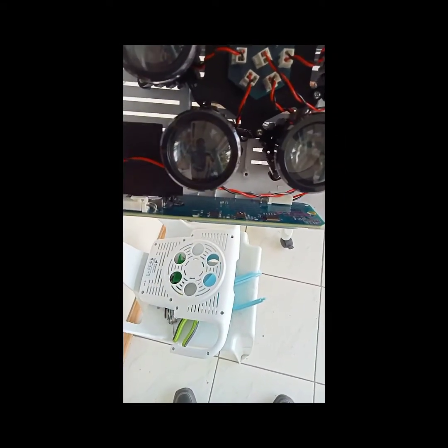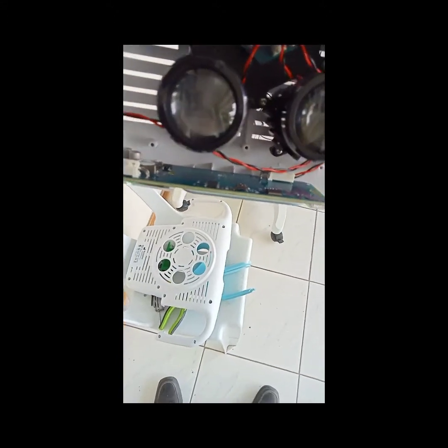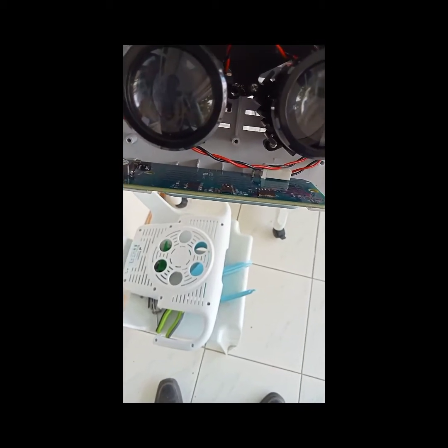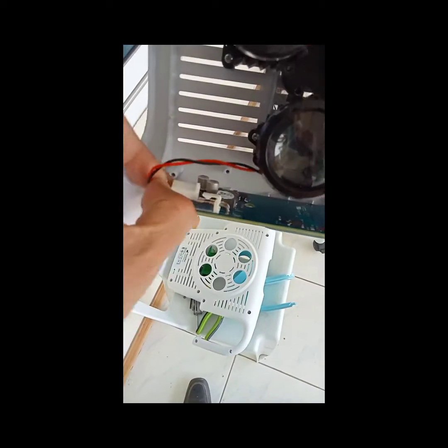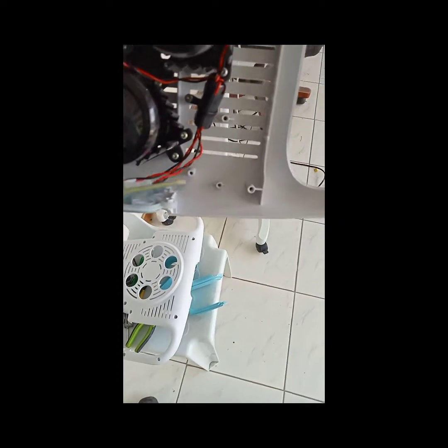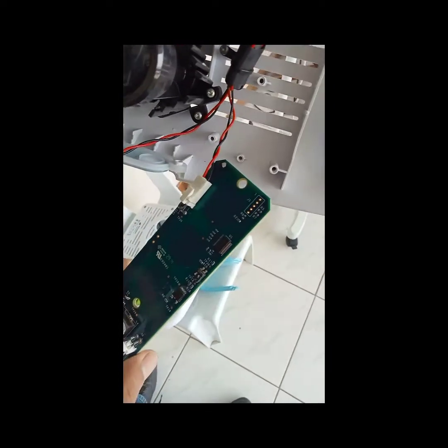We're going to check the board of the sensor. So we're going to pull this one out and see the components inside and check all of it.